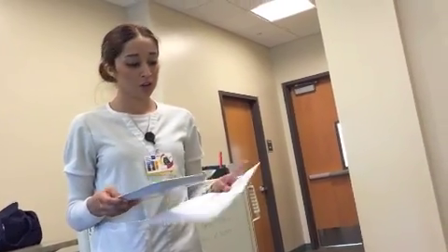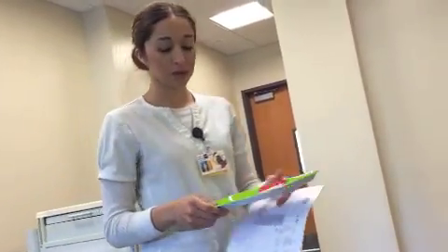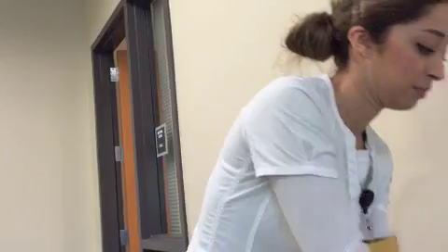So now I'm in the patient's room. You're going to knock. Introduce yourself. Hi, my name is Janet, and I'm going to be your nurse, and I'm going to administer your PPD test. Wash my hands. You want to verify you have the right patient.